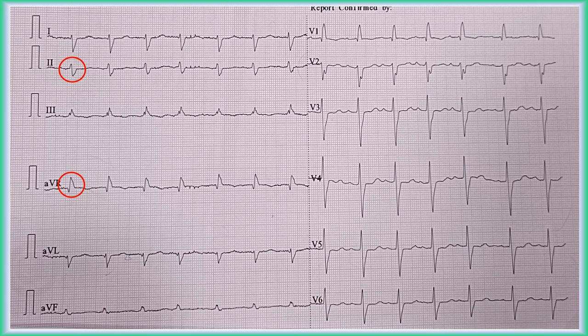In practice, the most common cause of positive deflection in lead aVR is wrong placement of limb electrodes; hence, always look for signs of right ventricular hypertrophy. In this ECG, there is a QR pattern in lead V1, prominent S wave in lead V5, and the transition zone — equiphasic QRS — is present in lead V6. All these features confirm presence of right ventricular hypertrophy.